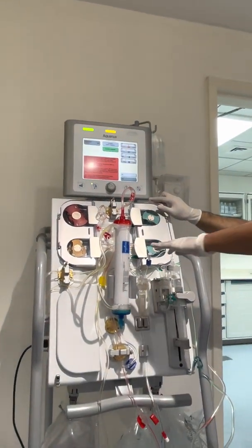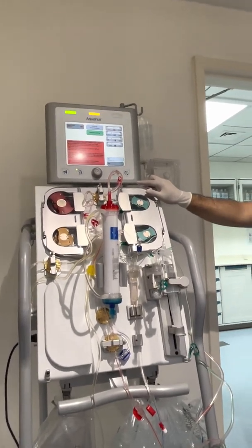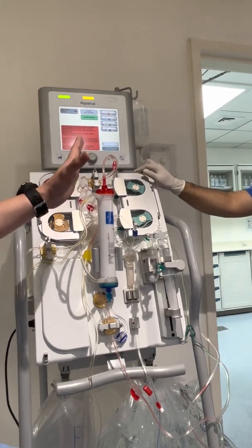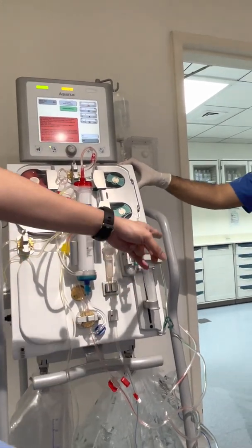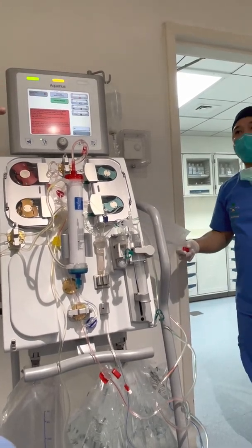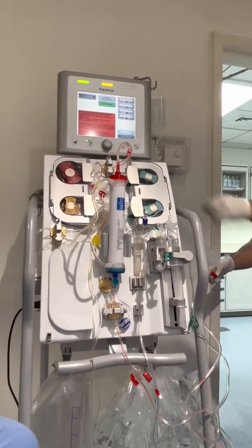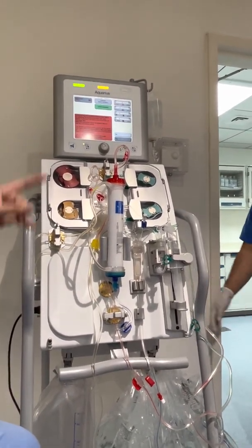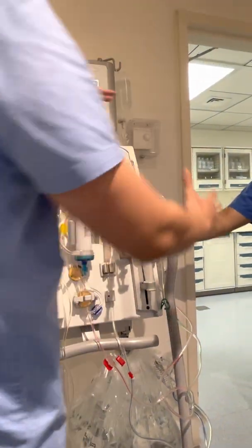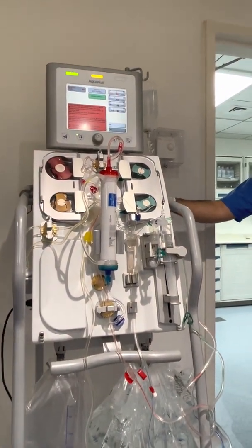Single connection, if there's risk. With single connection, if you want to push the fluid out from the machine, push it towards the effluent, not towards the patient. Then after that, you can choose double connection. If it is already primed with blood, just connect and start it. If you choose single connection, the machine will first push the fluids from here towards the effluent. That's the concept, just to prevent congestion or volume increase of the patient.